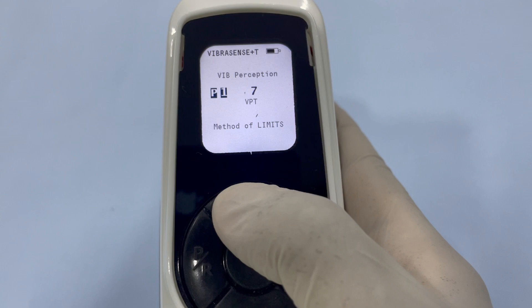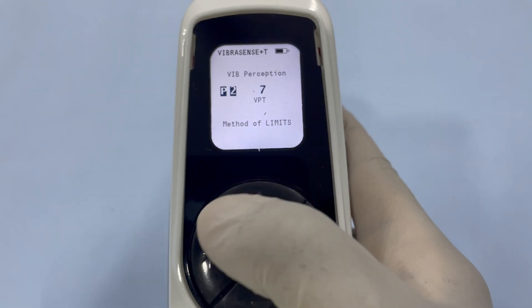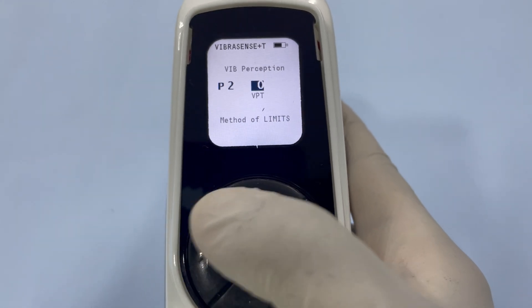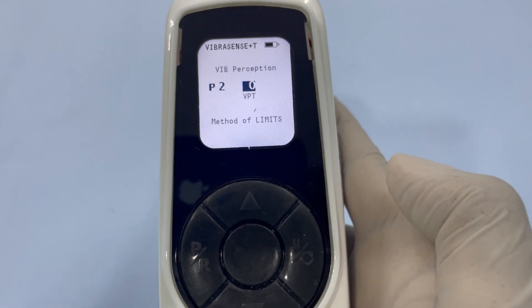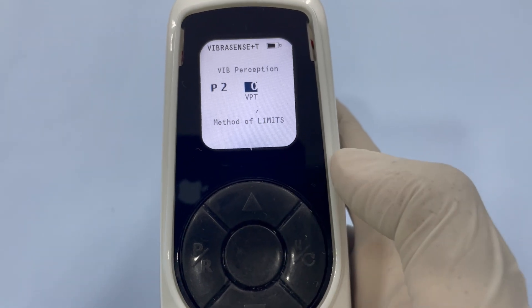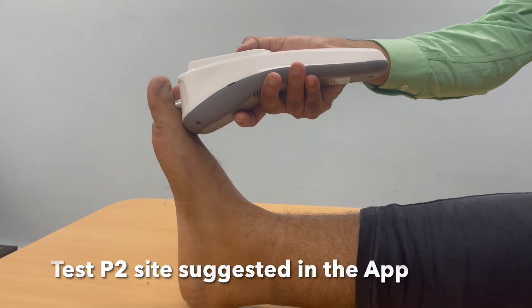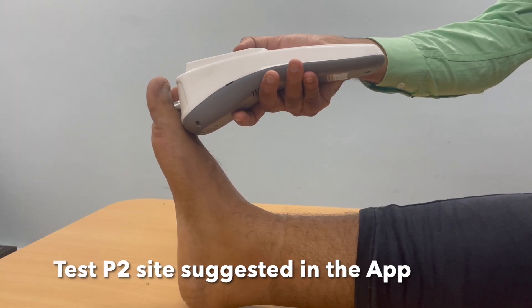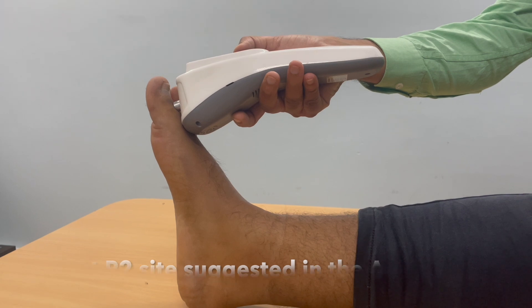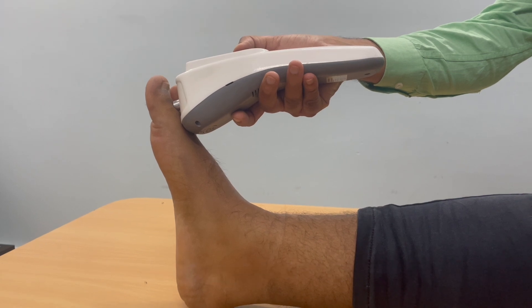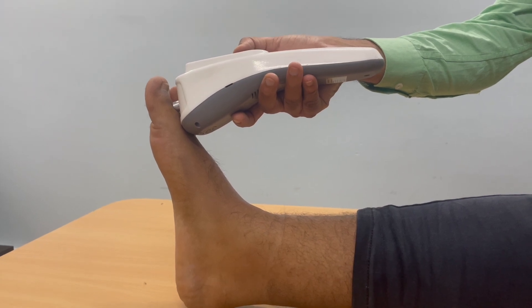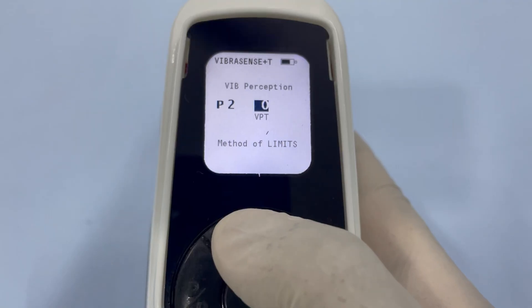Use the up arrow to select the next position P2. Press PR again to lock in this position for testing. Repeat the testing procedure at P2 by increasing the vibration stimulus until the patient feels it.